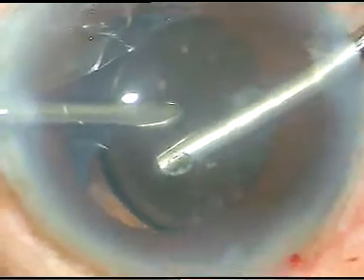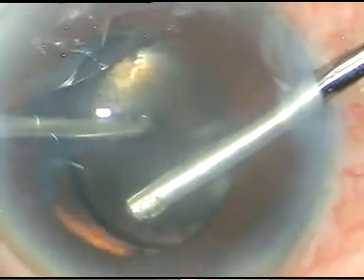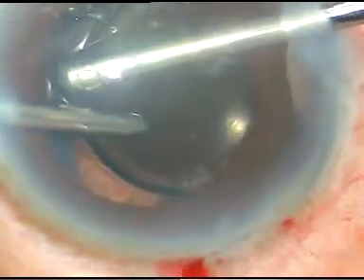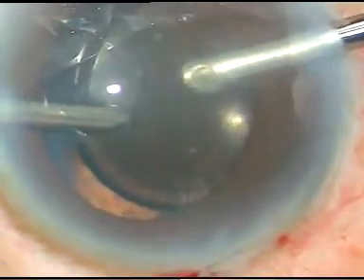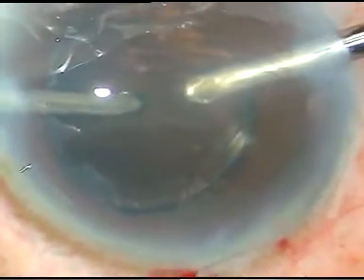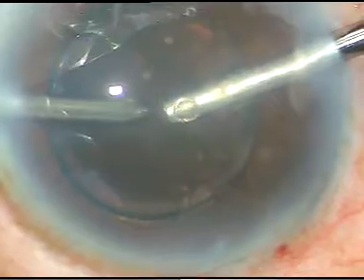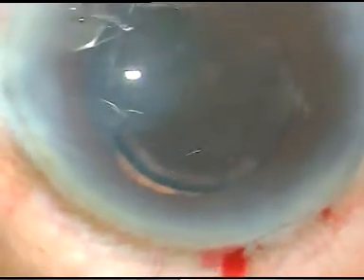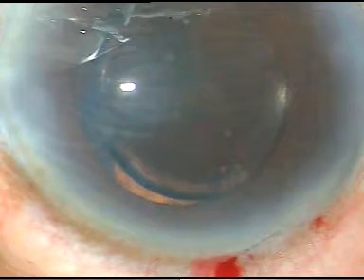matter which is there at the equator of the capsular bag. The bag is not intact. The posterior capsule has ruptured. And now what to do? How to remove this cortical matter?